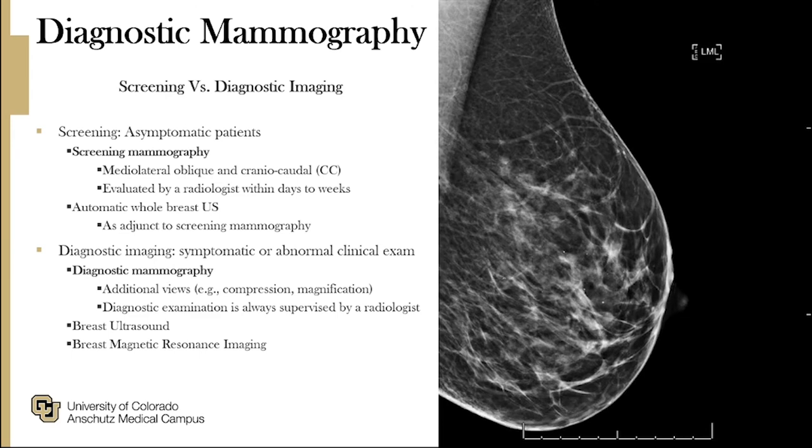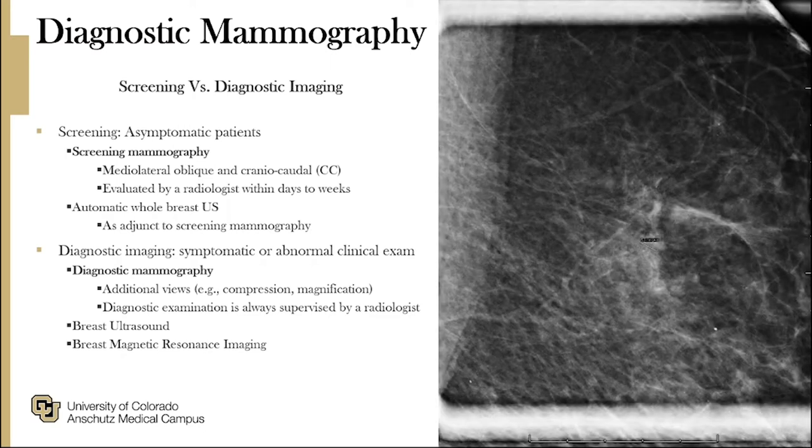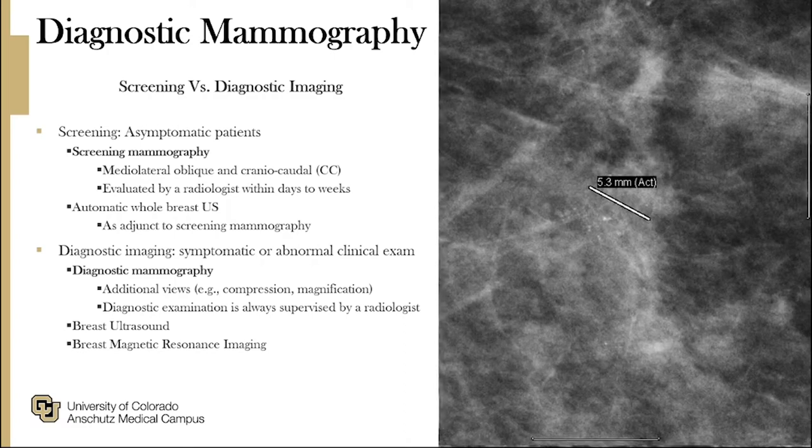In contrast to screening imaging, diagnostic imaging is always supervised by a radiologist and can include additional views, such as compression and magnification views. Here, our patient's diagnostic mammogram better characterizes the calcifications found on screening mammogram: clustered pleomorphic calcifications measuring 5.3 millimeters. It was given a BI-RADS category of 4. In contrast, screening mammography is performed on asymptomatic women and only two views are obtained, which are later reviewed by a radiologist within days to weeks.